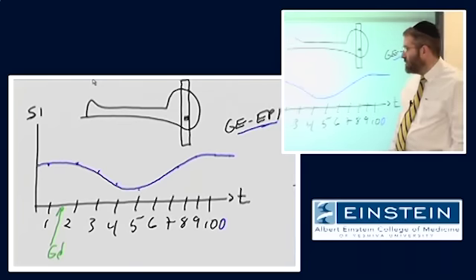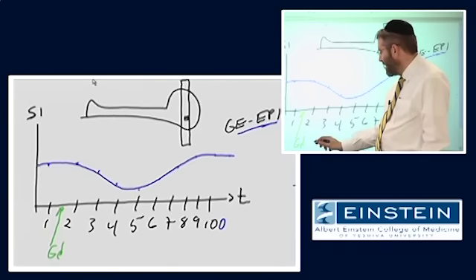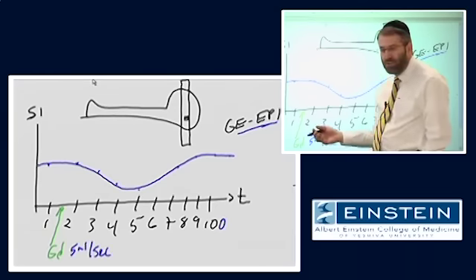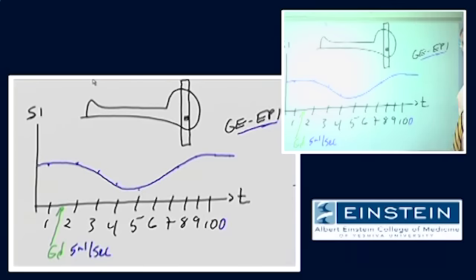But typically to do this, we inject the contrast at around 5 cc's per second. Some people inject it even faster than that. If you inject too slowly, this thing just gets diluted and stretched out. And this is how we do perfusion imaging in the brain.